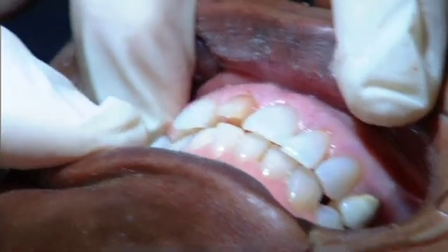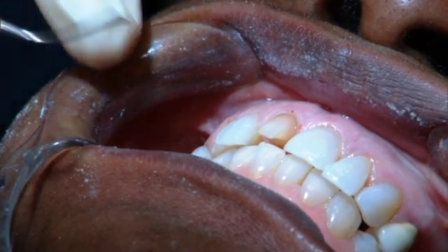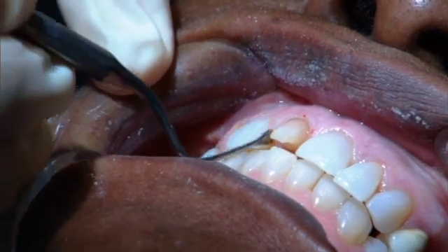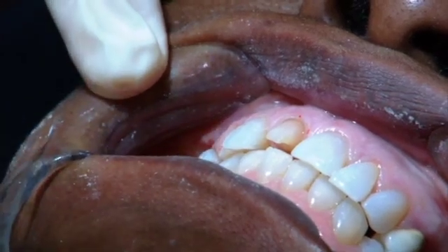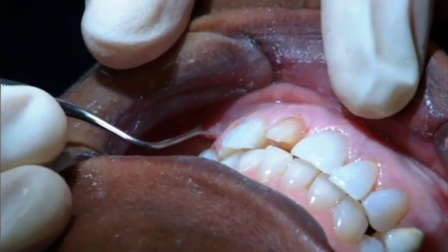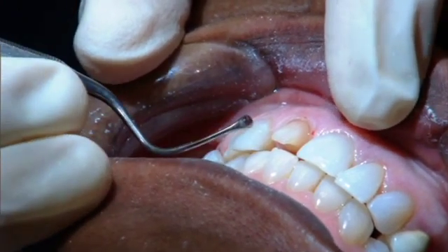We've gotten Beverly to close now, and what you'll be able to see, the amount of reduction that we have is uniform. The incisal reduction as well as the lingual. You'll also see we've got a uniform amount of thickness for our porcelain interproximally. We have plenty of room to work. You'll also notice that everything's clean. We haven't chewed the tissue up and we haven't really scarred things up. When we take these teeth out, we'll have nice clean areas to work in.